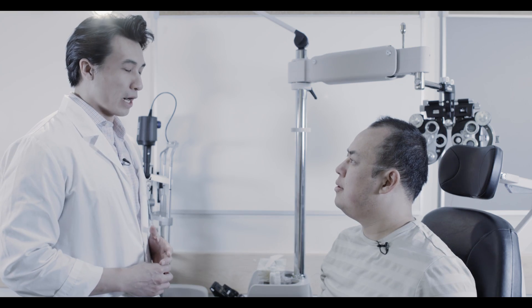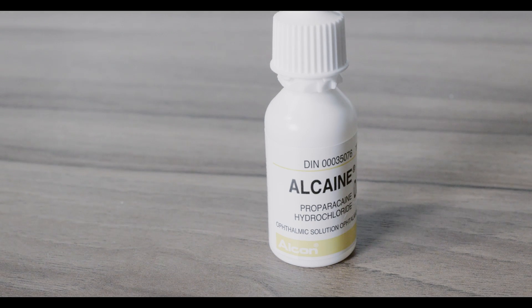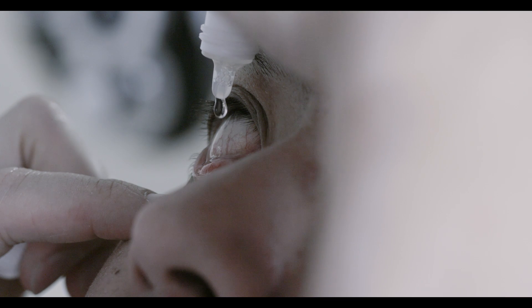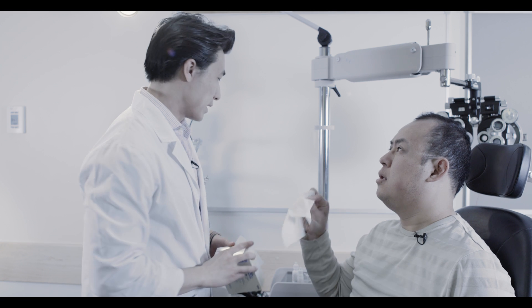So we're going to test the pressure of your eyes now, but before we do that I'll put some numbing drops in. Alcaine drops are commonly used to numb the surface of the eyes. Administer one to two drops of Alcaine in each eye. Feel free to dab, but try not to rub or wipe the eye.